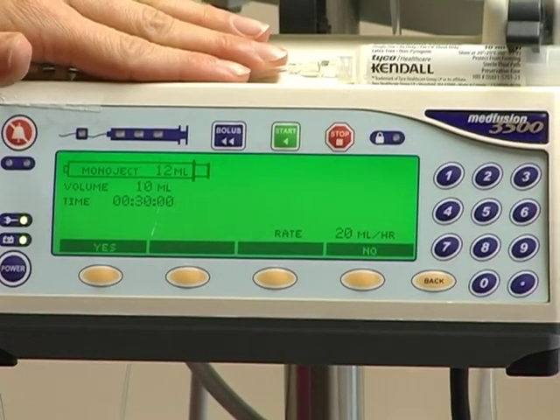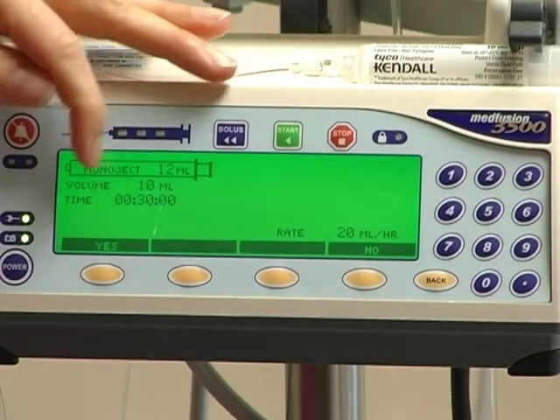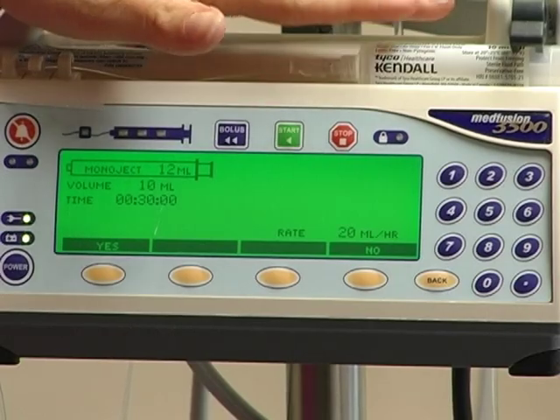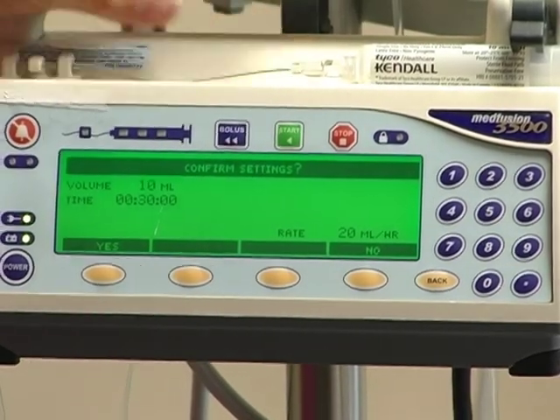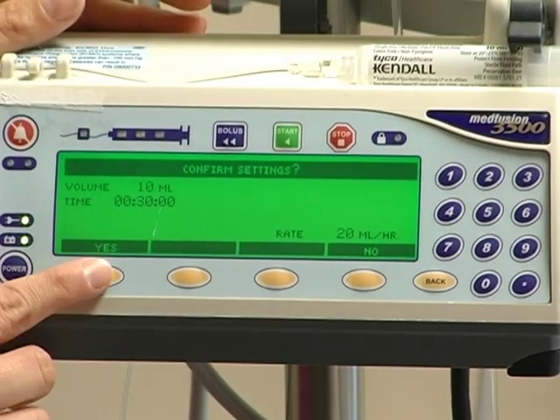It will always ask you to confirm your settings. The last screen will give you your volume and your time, the syringe size you're using, and it will compute the final rate for you. If that is all correct, you click yes.